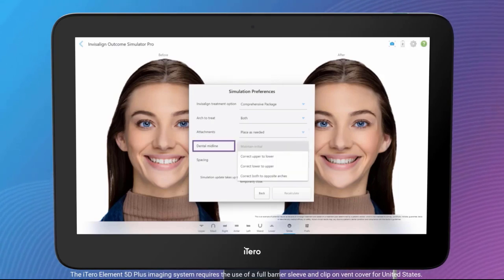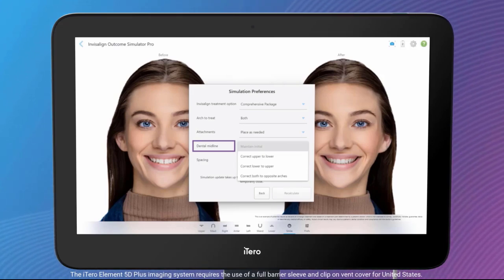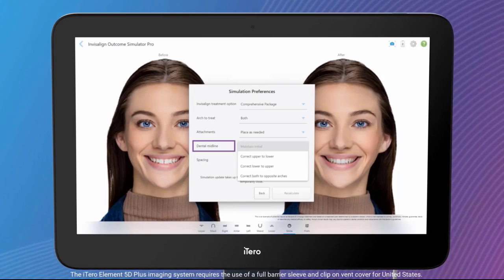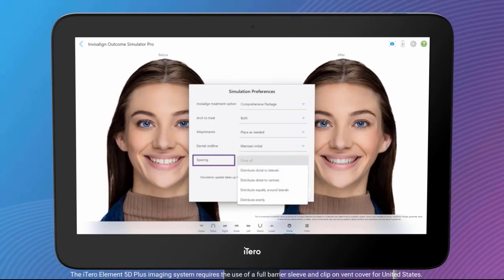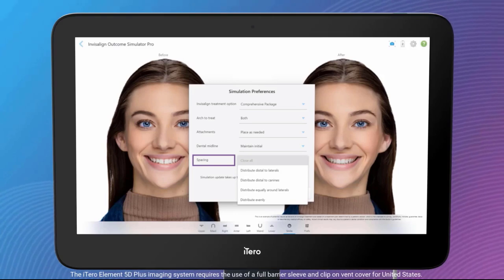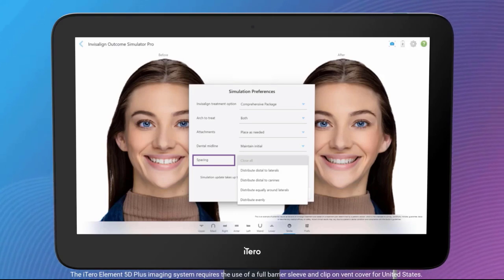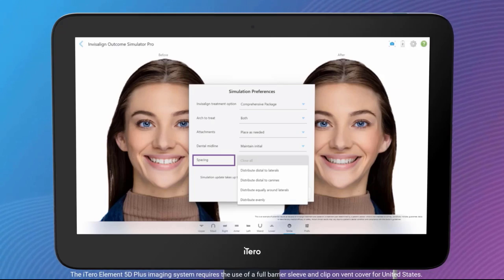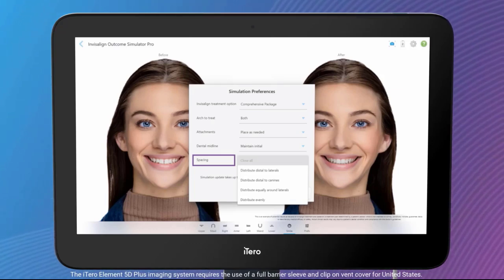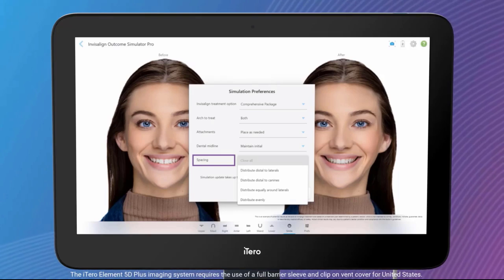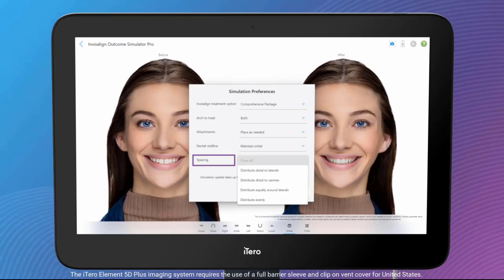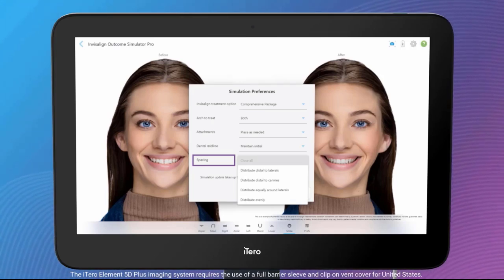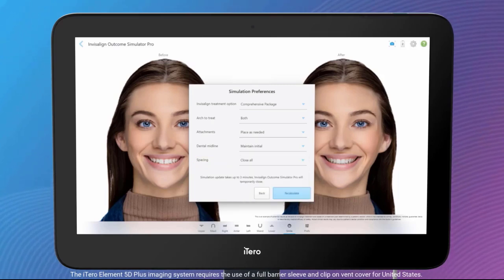Dental Midline: choose how to treat the dental midline — to maintain the initial midline, adjust upper to lower, adjust lower to upper, or correct both to opposite arches. Spacing: choose how spaces are handled. Preferences include closing all spaces, distribute distal to laterals, distribute distal to canines, distributing equally around laterals, or distribute evenly. Note that the ability to adjust individual teeth and mark missing teeth is not yet available with Invisalign Outcome Simulator Pro.